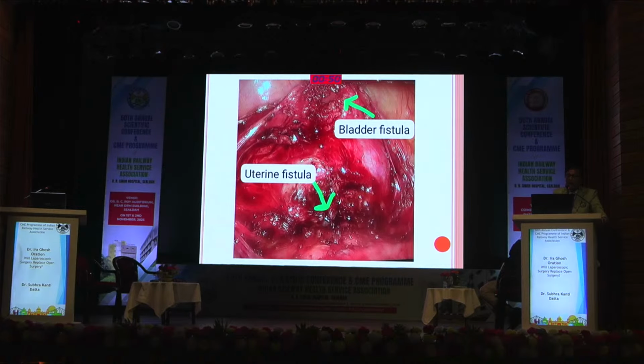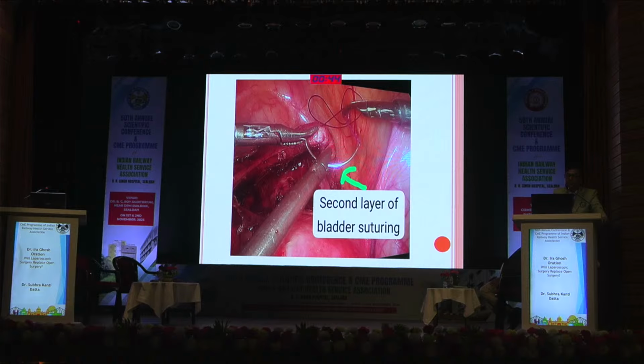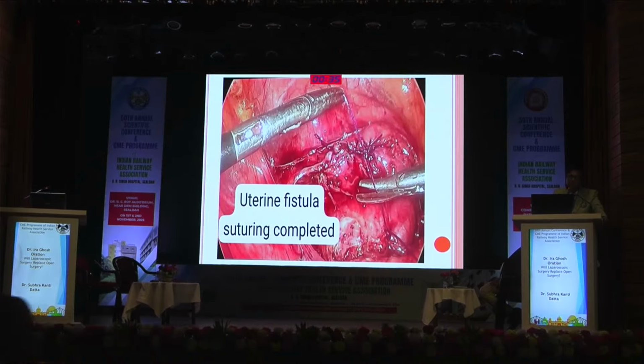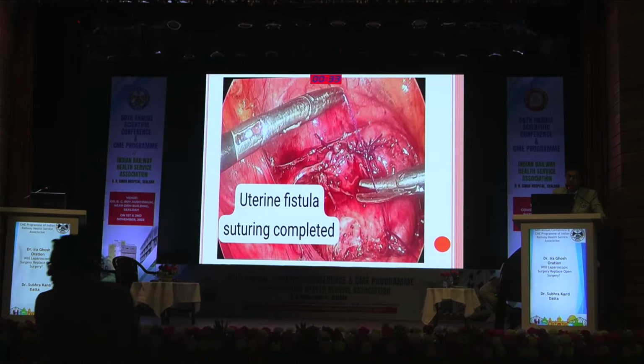The first layer of the bladder suturing was done. Second layer of the bladder suturing was done. The bladder suturing completed, the uterine fistula is being sutured. The uterine fistula suturing is also completed.